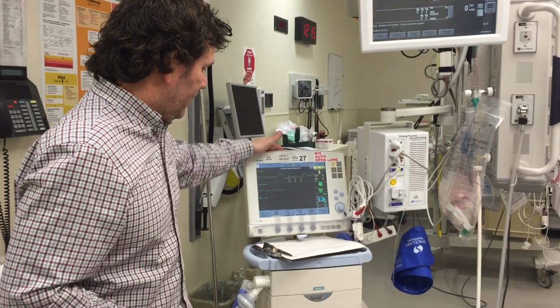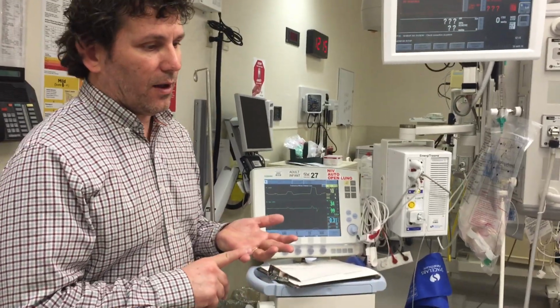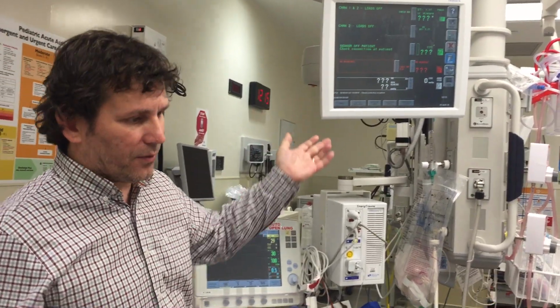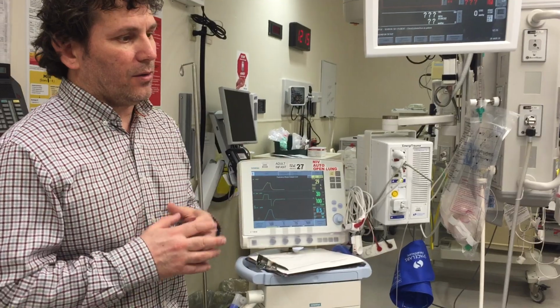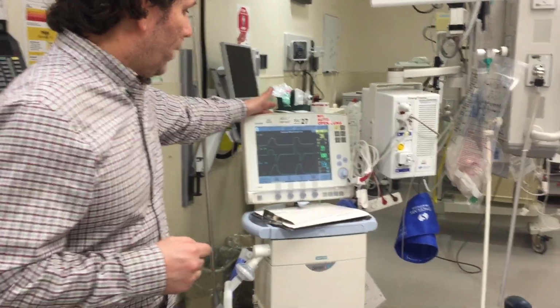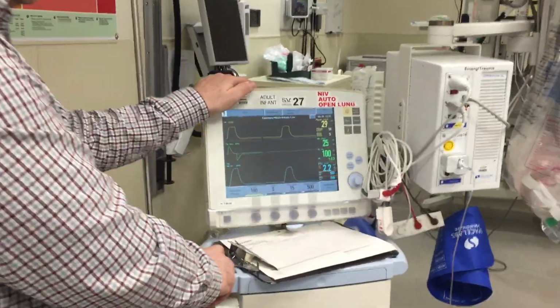So now that we're ventilating, how do we know we're ventilating? Of course you're going to do your auscultation of the lungs. We're going to look at our end-tidal CO2. We have no end-tidal CO2 because there's no patient, of course. And you're going to look for chest rise, that sort of thing, with our waveforms. Actually, we'll talk about alarms right now.